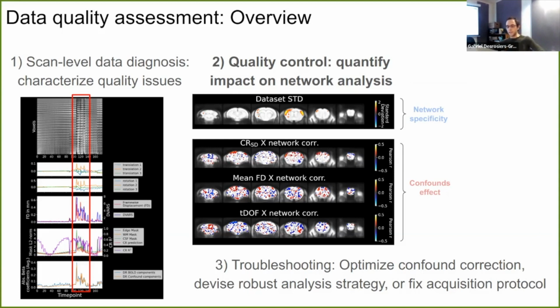Essentially, we have access to more features that we can observe in the spatial contrast of connectivity when we look at a single network at a time. They're designed for you to look at different regions of interest, see where in the brain you have pretty good mapping of brain networks, and hopefully that can inform your analysis. And I think it's going to become obvious why this is useful in the next few slides.